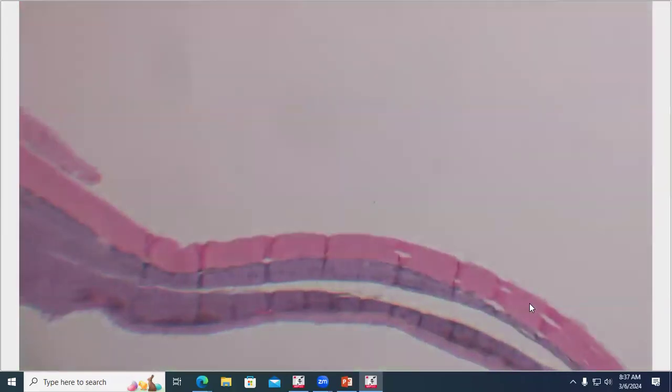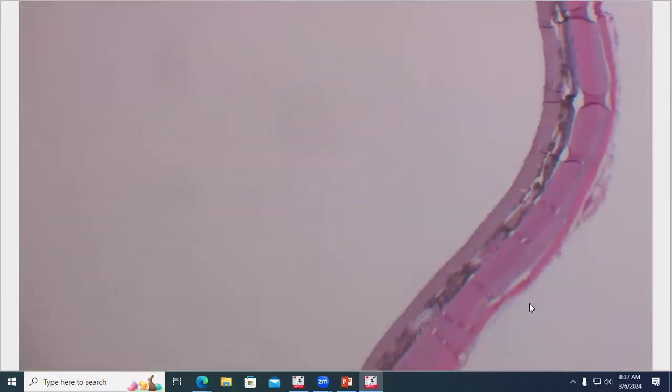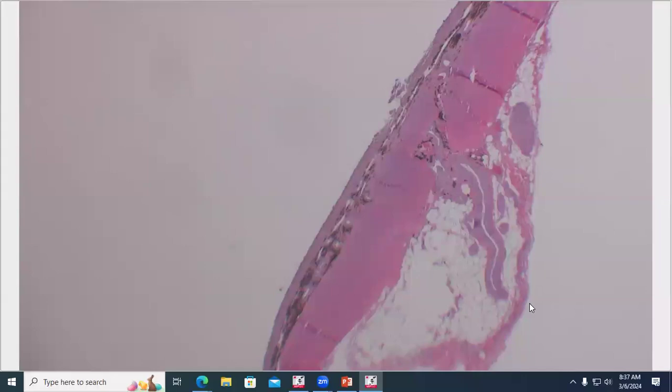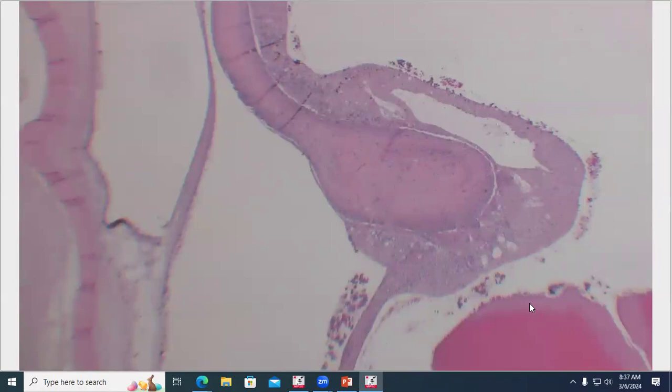Here it does extend a little bit into the choroid, but kind of peters out as we hit towards the back of the globe, where we didn't sample the optic nerve or optic nerve head, but this is about where it probably should be entering, but it stops well before that. And then, as this is, like I said, sort of an extension of a neoplastic transformation of the lens epithelium, sometimes they still produce basement membrane material amongst the neoplastic cells.